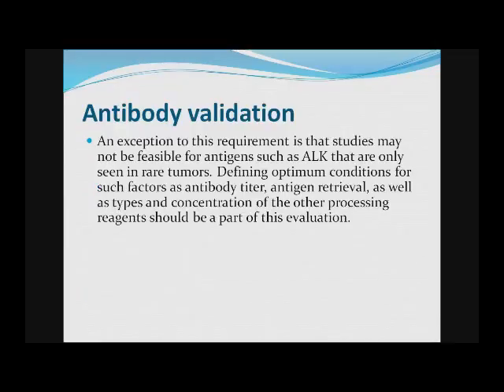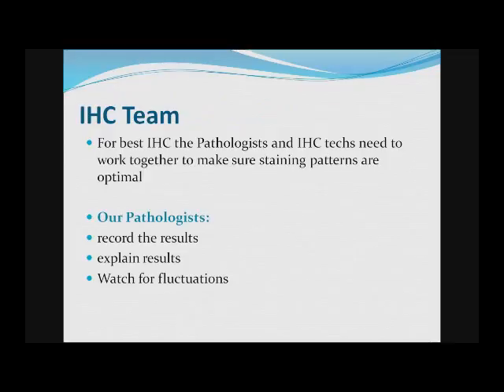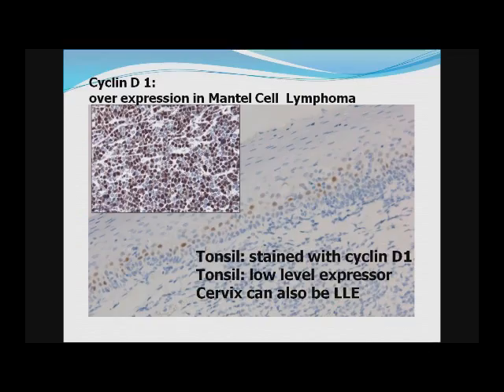Now, an exception to the number of slides that you have to test can be ALK, because there's so few ALK positive cases that you would have a hard time getting 10 positives and 10 negatives. Our pathologists and the techs do work together very well, and the pathologists do record the results of this, and they look at the slides. They explain when problems happen, and they also watch for fluctuations.